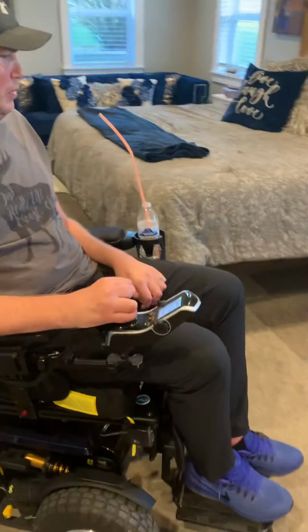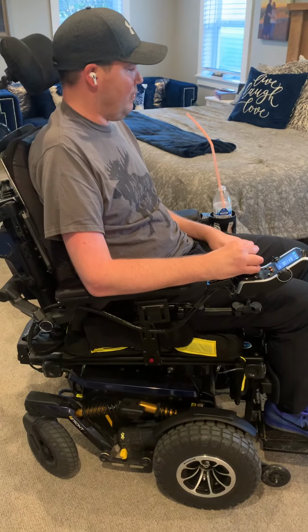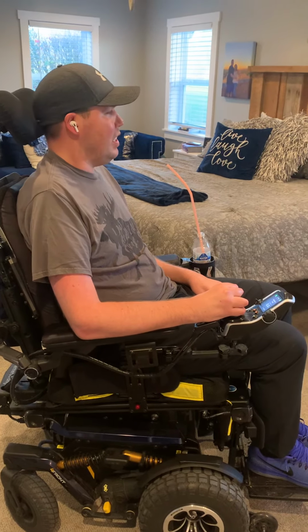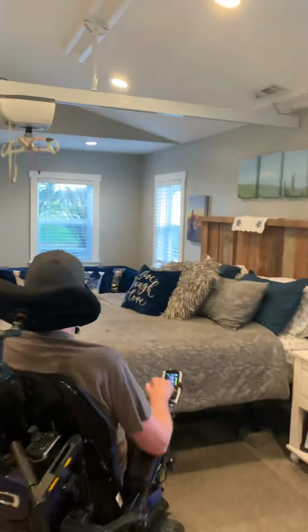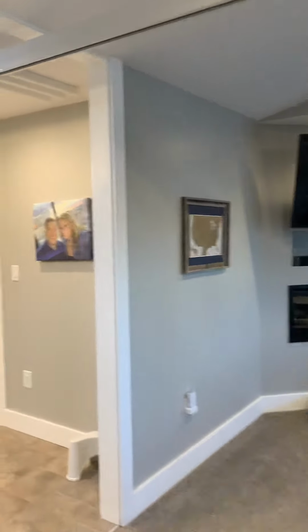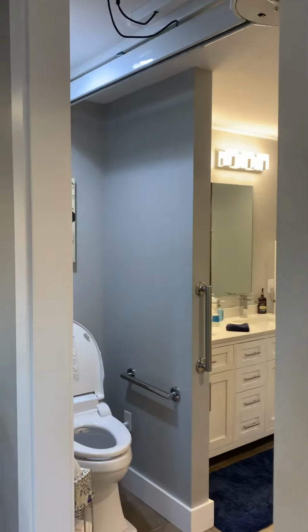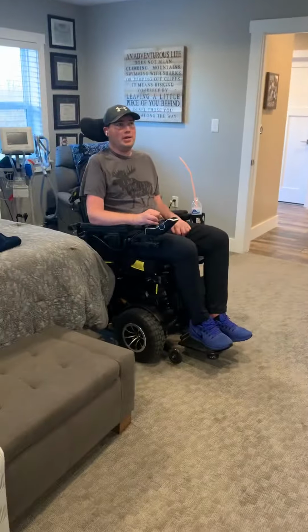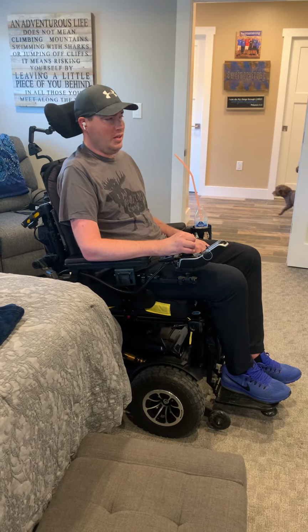We have our adjustable bed, which is a must, and I'll do a separate video about that, but it's two separate twins. And then up in the ceiling, we have a ceiling lift that goes from the bedroom into the bathroom and almost to the shower for a shower chair. Currently, I still walk, so I use my walker when I shower, but occasionally we have to use the ceiling lift to help me get around.